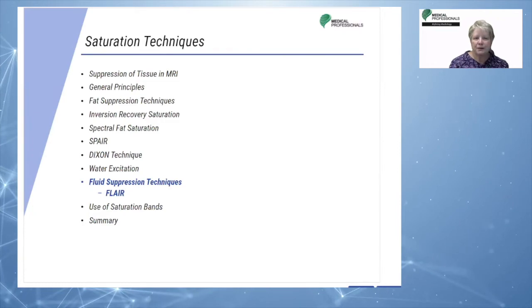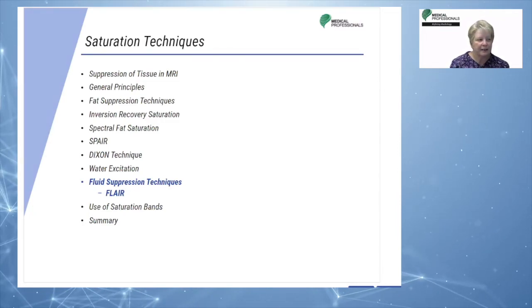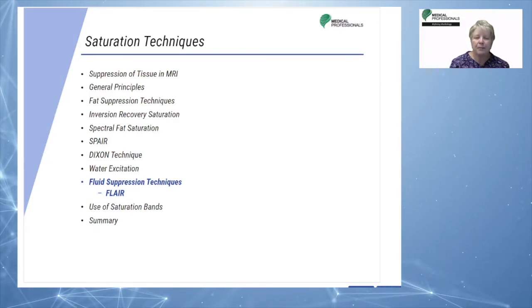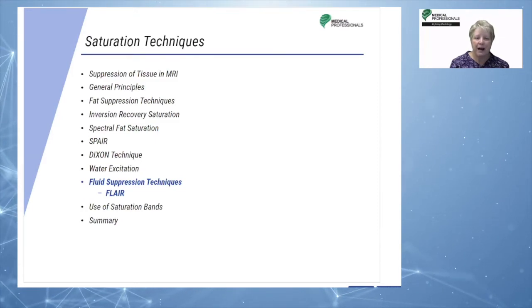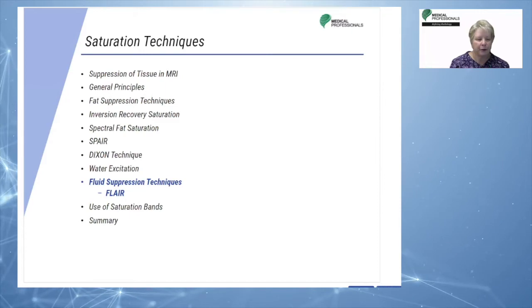As promised, the fluid suppression technique of FLAIR will be discussed next. If you recall, the Dixon technique discussed earlier provided the ability to suppress water or fat. The FLAIR, on the other hand, can only suppress fluid or water.